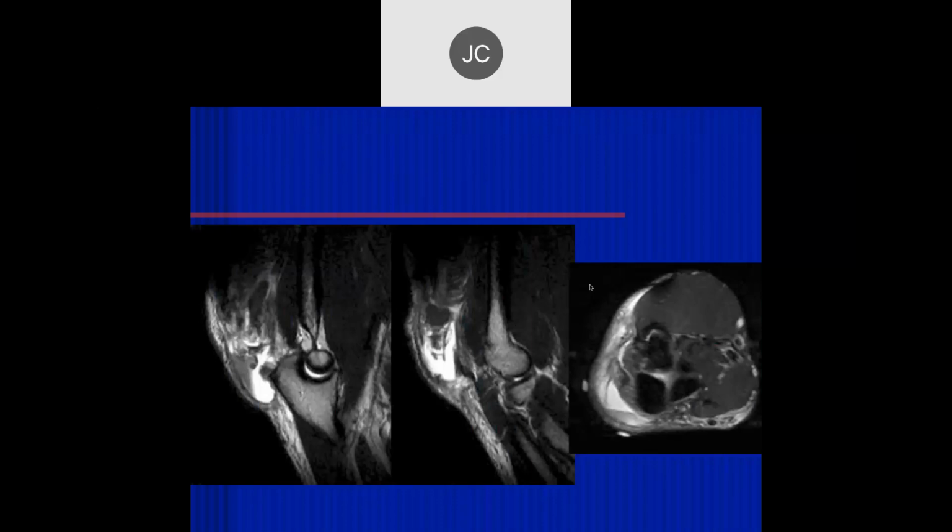All right, so again, looking at that triceps region, it looks like there's a full thickness tear of the triceps and a big hematoma adjacent to the fluid collection. What would you do with it? I think this would probably be referred to surgery and maybe they could reattach it. Well, you have a piece of probably tendinous portion of the muscle attached to the olecranon there on the tip. We don't have any other acquisitions, so if it comes off the bone, it's easy to fix. If it doesn't, it may be a little more difficult, but that's fixable. But you would have to leave the arm in extension for a period of time, and people don't like to do that very much.